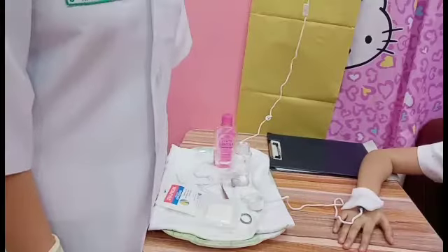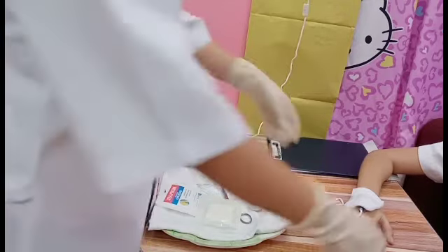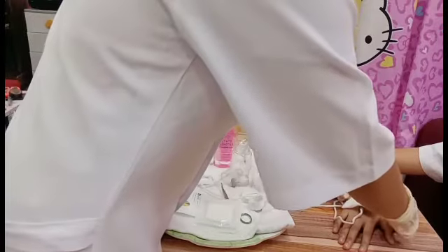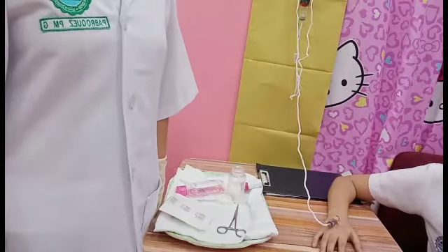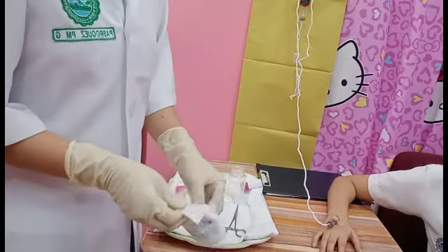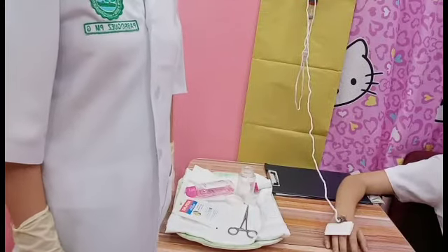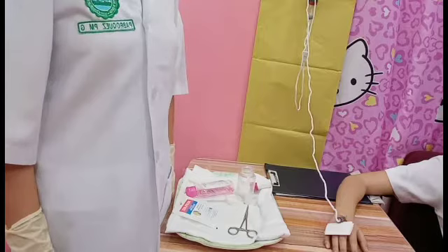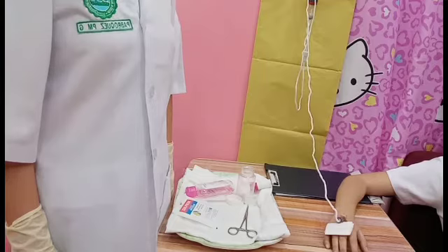Next is to loosen tape at IV insertion site. Don clean disposable gloves and carefully remove dressing and tape. May I remove your dressing? Next is to place sterile gauze square under needle hub. Next is to prepare the new IV tubing and loosen protective cap. Clamp the old IV tubing. Steady the needle hub with non-dominant hand until change is complete. Remove tubing with dominant hand using a twisting motion.